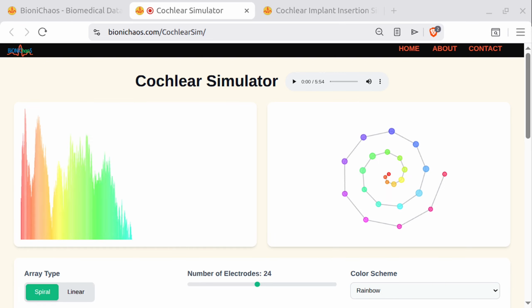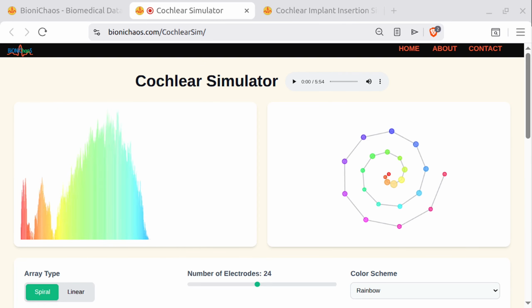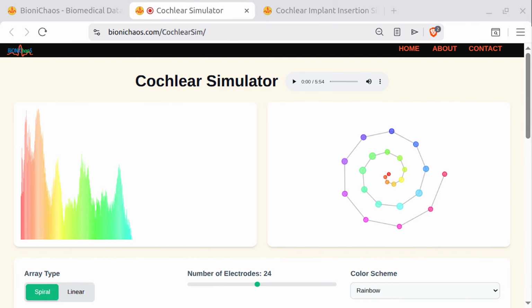There are soft failures where the implant doesn't completely die, but the patient suddenly experiences intermittent static, bizarre sound distortion, or software glitches. Right, which require reprogramming. Or worse. And then there are hard failures. The internal computer chip just dies. The lights go out. The only fix is to put the patient back under anesthesia, cut them open again, and surgically extract and replace the entire internal unit.